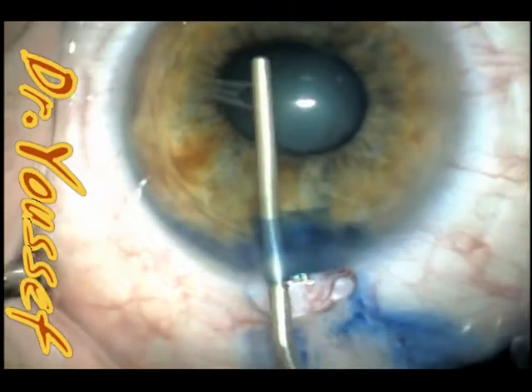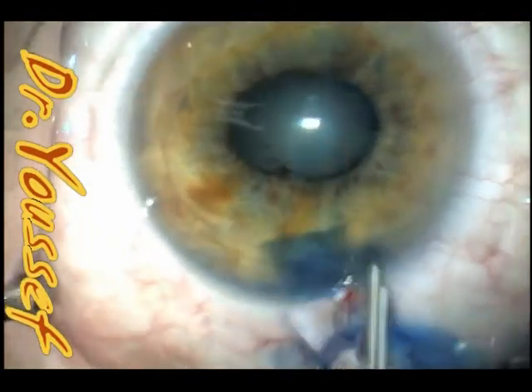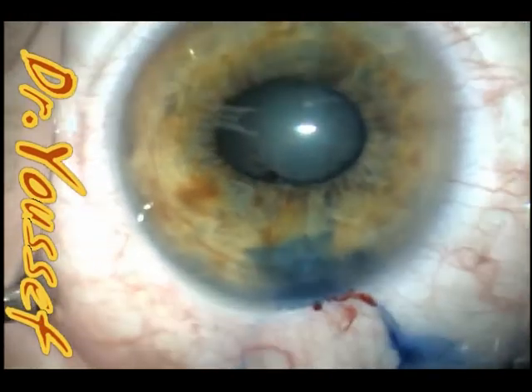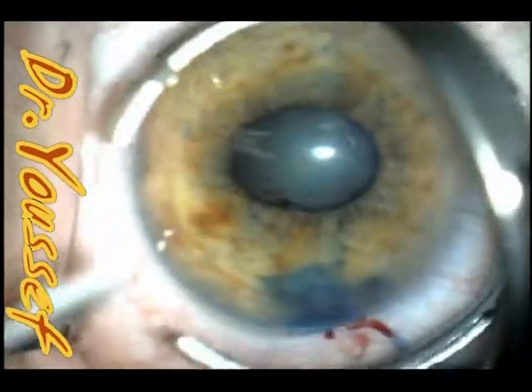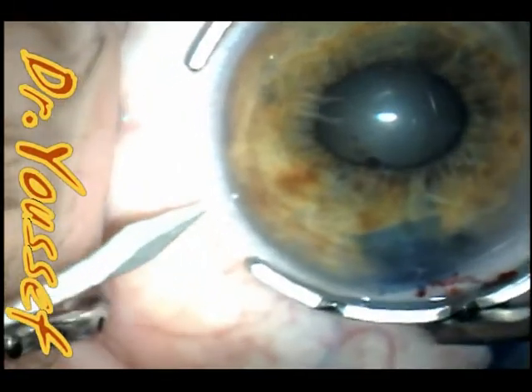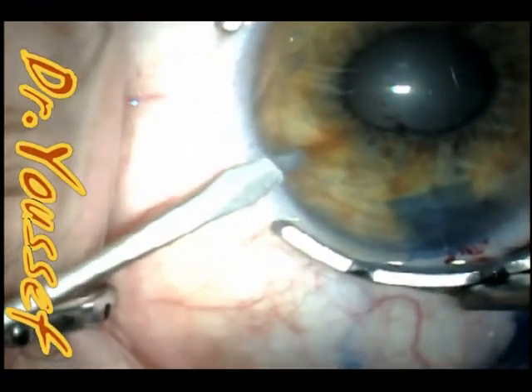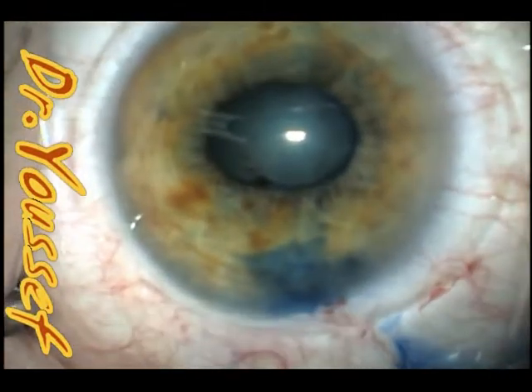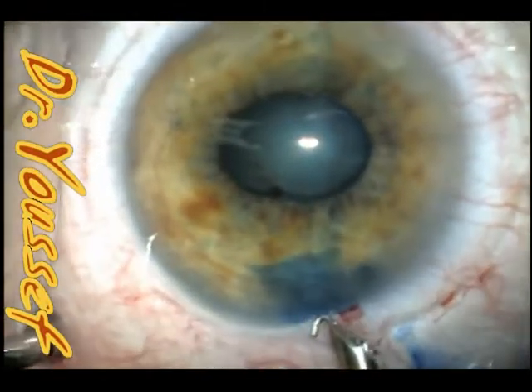I'm breaking the total posterior synechiae now with a spatula. I usually use vision blue to stain the capsule without putting any air — just inject it into the anterior chamber. It pushes out the contents of the anterior chamber and replaces it with the vision blue. It works and stays very well without putting air or viscoelastic.